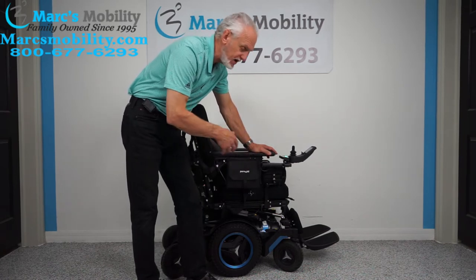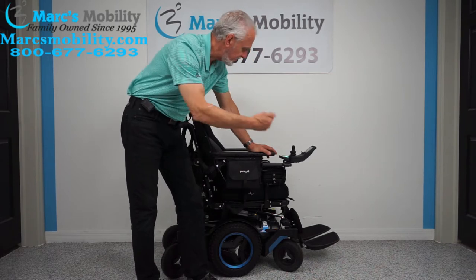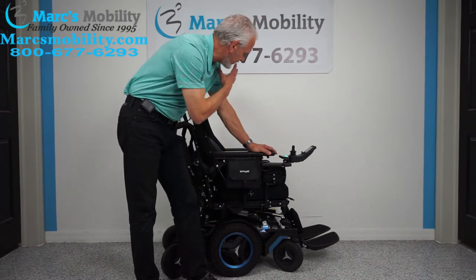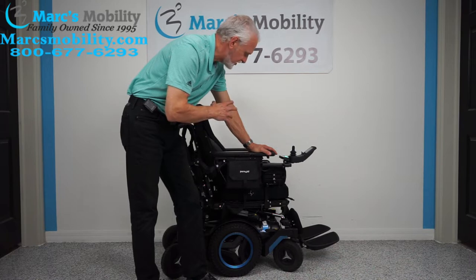It is fully loaded — it has the 14-inch seat lift, the electric tilt, the electric recline, the electric feet. It has the light package on it, which we'll cover as we go along. It has all kinds of other custom parts on it that we'll check as we go along.